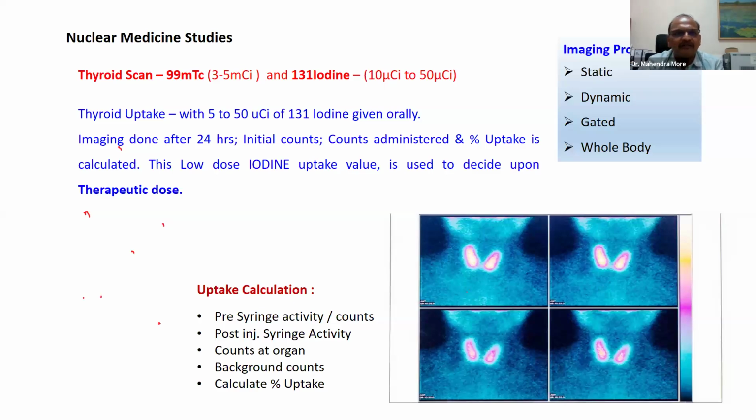Now come to nuclear medicine studies. As I told you, the thyroid scan can be performed with iodine and can also be performed with technetium.